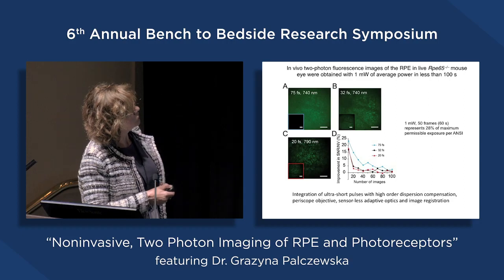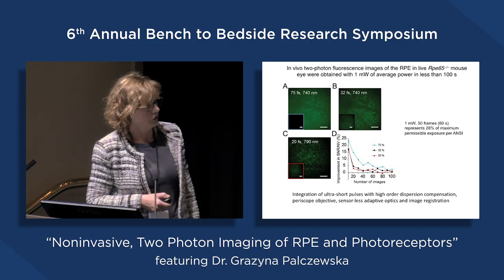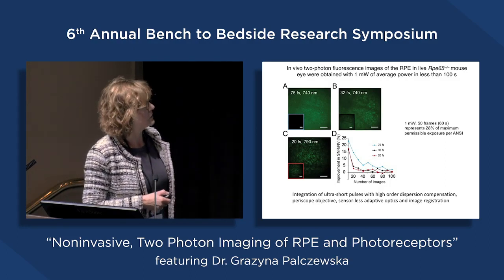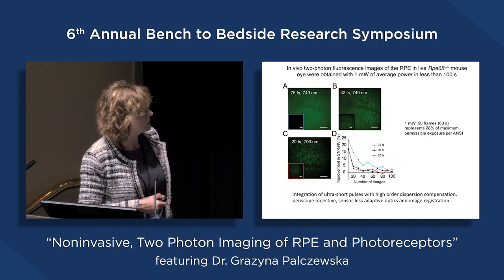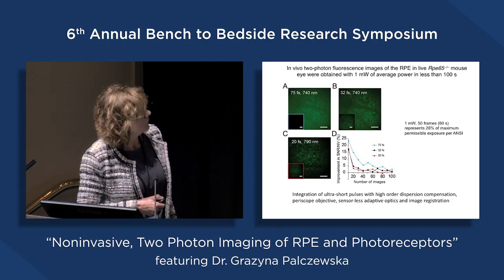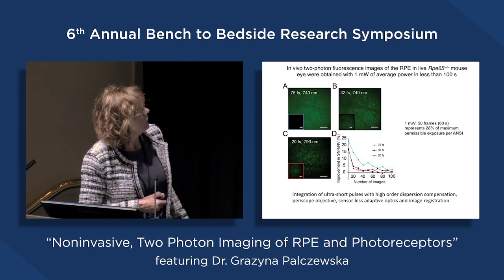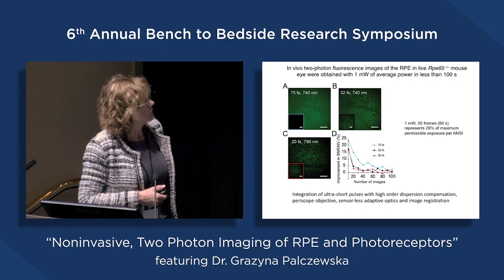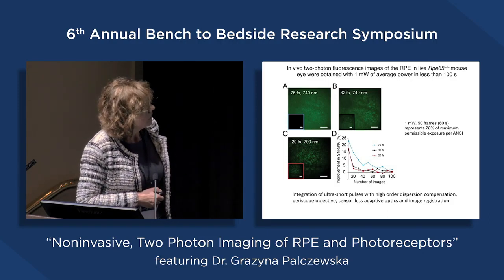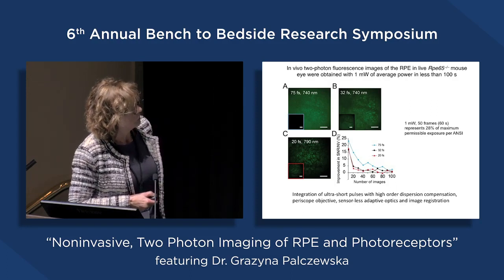So these large images are the images that were obtained, aligned, and averaged after collection of 100 imaging frames. And this is with each of these lasers, 75, 32, and 20 femtoseconds. Clear features of the RPE could be visible for both the 20 femtosecond and 32 femtosecond laser. However, only the very abstracted outline of the RPE is visible here. And insets are showing the images obtained from the averaging of 50 frames.